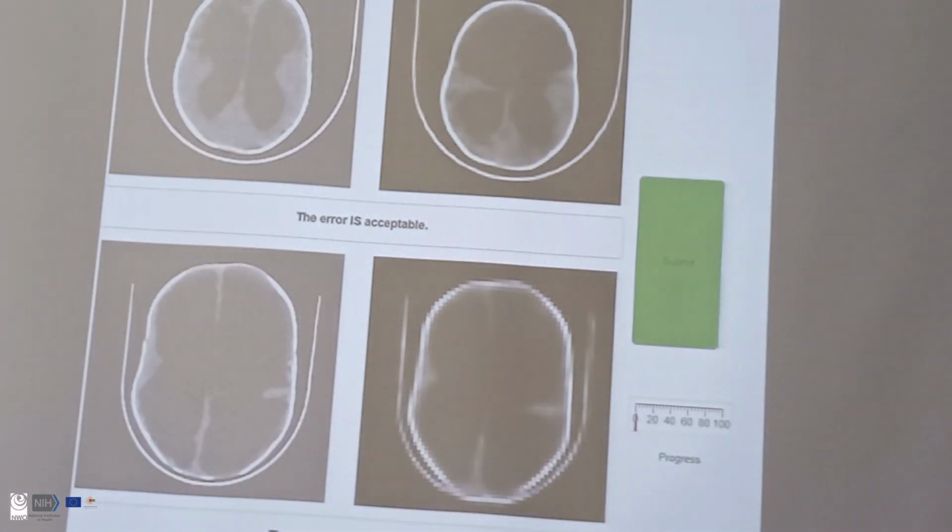So what do you think? Would this matter? Do those look the same to you guys? They don't look the same, do they? What's that? Yeah. So can you think, for hydrocephalus, what is the significance of the ventricles looking larger?